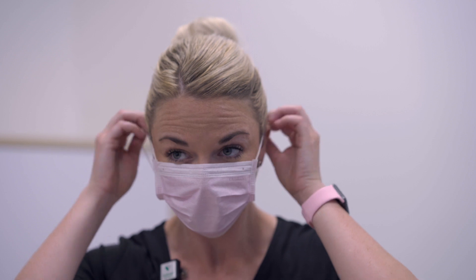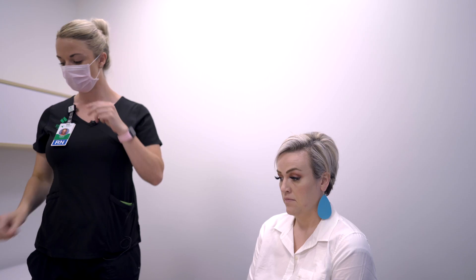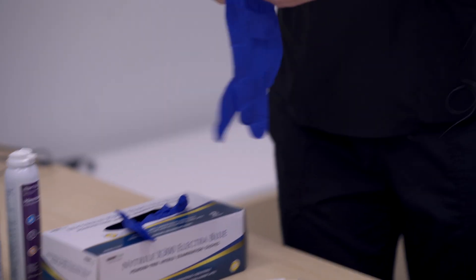First you will want to perform hand hygiene with some hand sanitizer or some good hand washing. You'll also want to place a mask in case the patient sneezes. And then you'll want to put on your gloves.